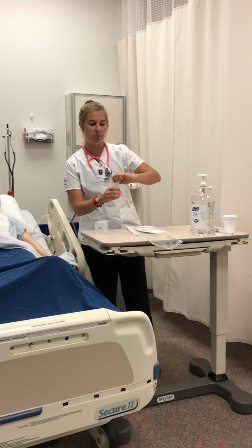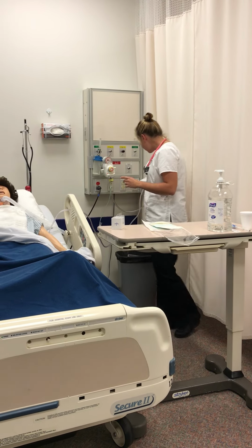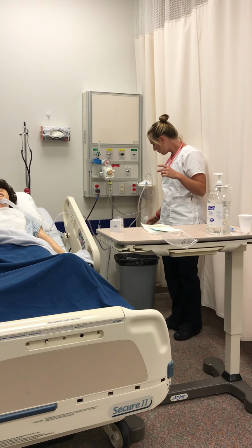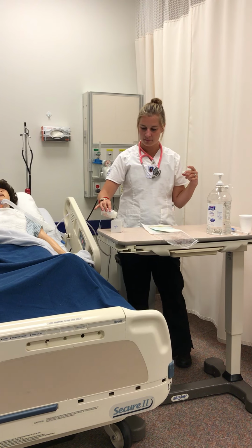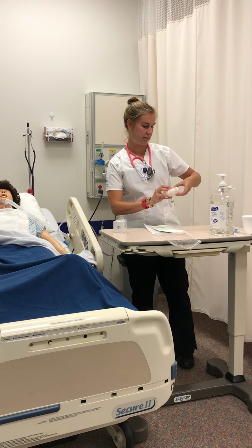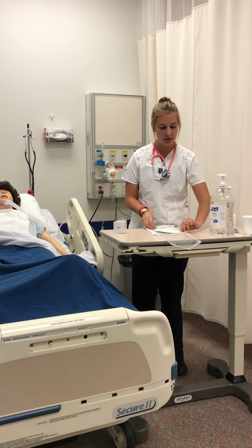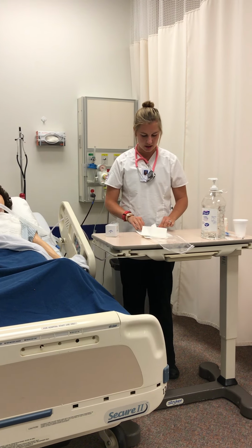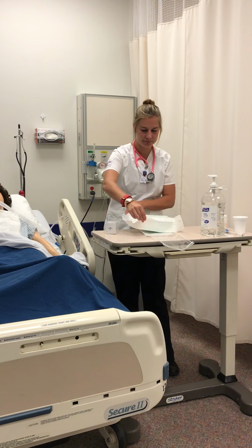All right, so I'm going to pour the saline solution into the trash can lid. And then pouring some into my basin. And then going to open up my sterile field, only touching the edges of the paper, about an inch on each side.